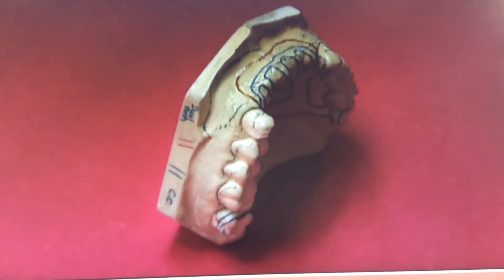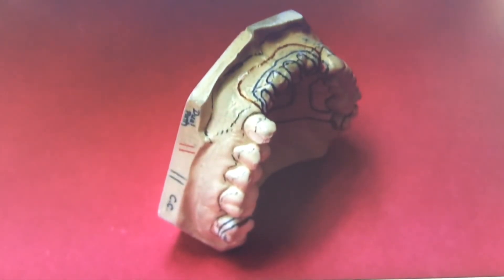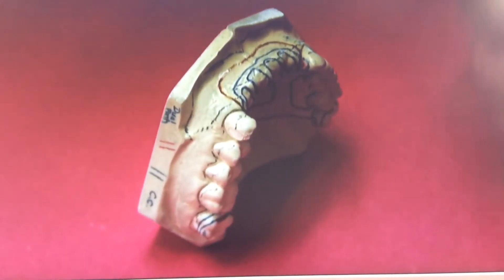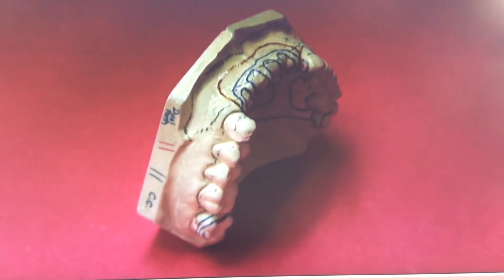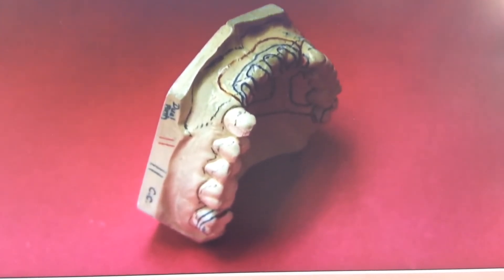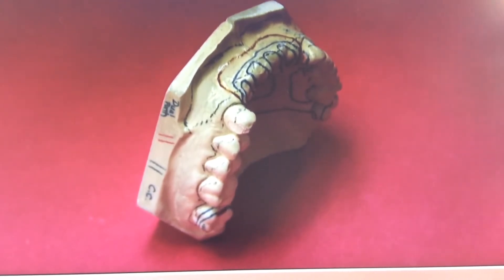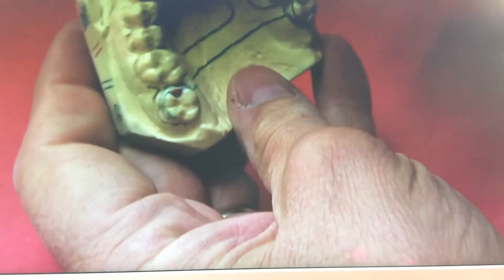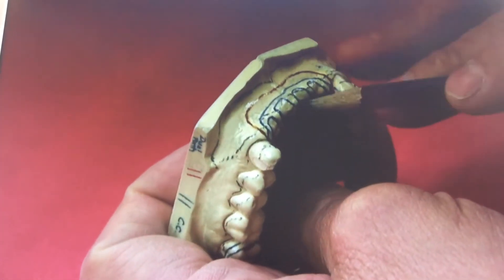An alternative for the anterior region would be to use mesh instead of the open lattice. With mesh, you don't have all the struts between the holes — the acrylic processes into much smaller spaces, so there's less bulk of acrylic. There's some controversy that mesh may not retain as well, but I've used mesh for 26 years in practice without that being a problem, so I would not be afraid to use mesh.